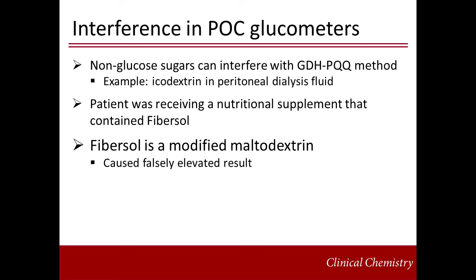In this case, the patient was receiving a nutritional supplement that contained fibersol, which is a modified maltodextrin. Since maltodextrin is a sugar polymer, this scenario parallels the incidences addressed by the FDA.